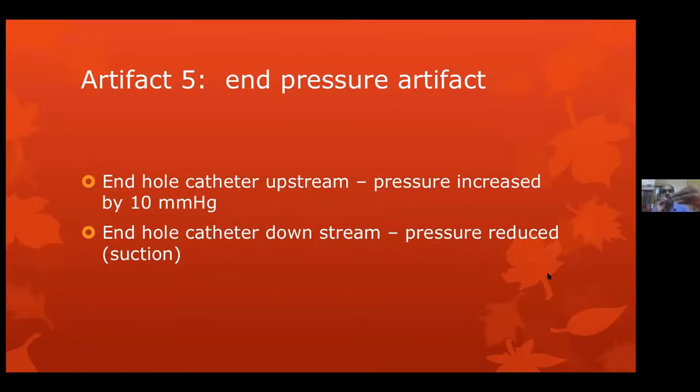Into that, I am pushing in the kinetic energy of the blood impinging during each left ventricular systole into the end hole of the catheter. So, along with pressure energy, I am adding a kinetic energy of ejection. Both combined lead to an increase in the pressure of 10 millimeters of mercury. Maybe it is something similar, but two different physics principles.